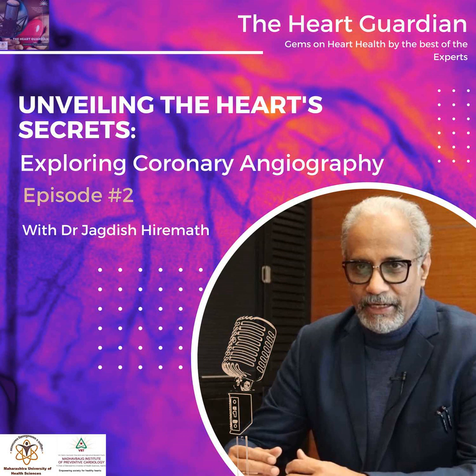The cath table can be moved in 4 directions. It is fitted with a C-shaped arm of X-rays. The X-rays pass through the body of the patient and are captured on the other side by the image intensifier. A highly sophisticated software generates a video of 10 to 12 seconds. This detects the flow or shows us the arteries and its branches.